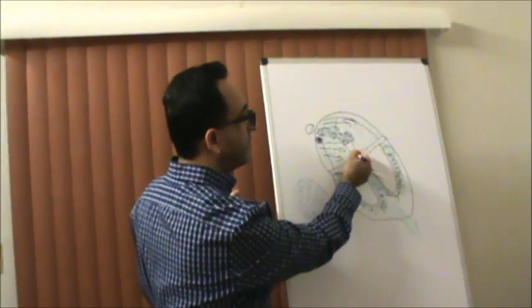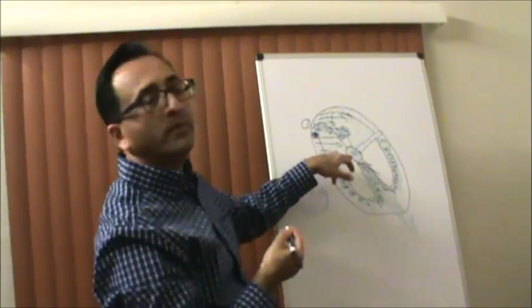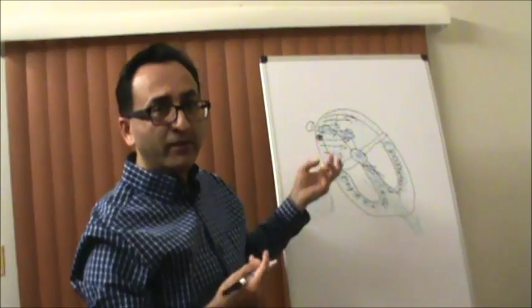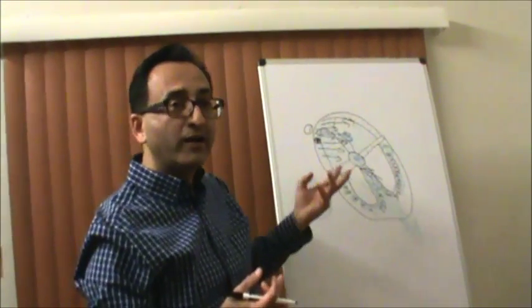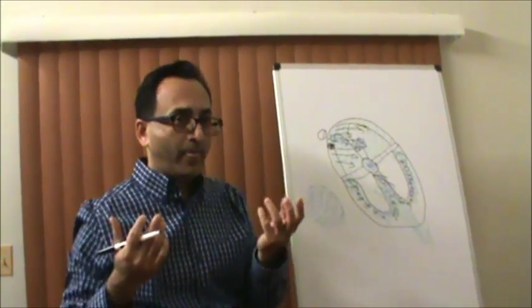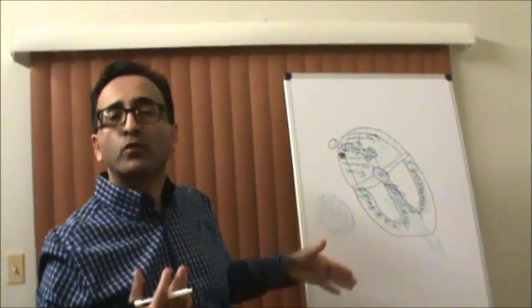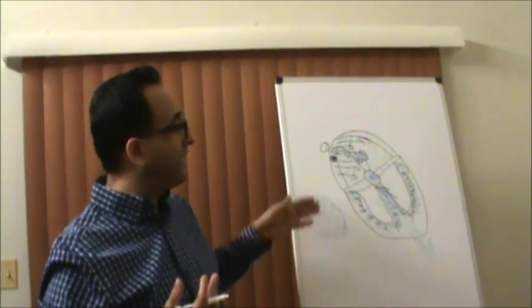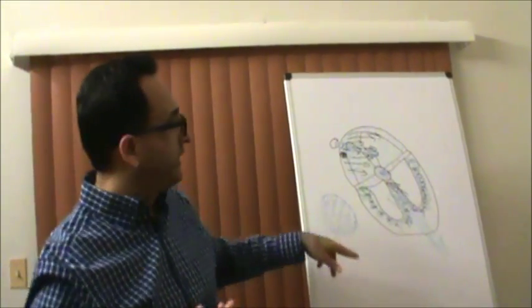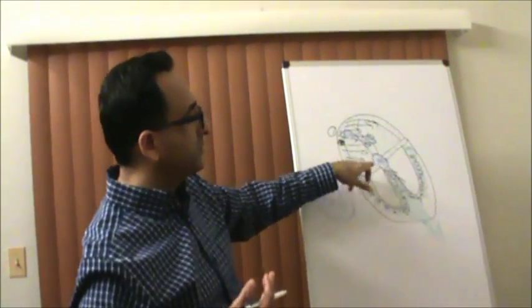Nothing gets noticed on the ECG paper at the time of the stimulation of the AV node, because the AV node is a small tissue compared to the heart, plus the composition of the AV node is such that it slows down the process. It has calcium as opposed to the sodium when we are looking at the Purkinje fiber. So that is the second event that takes place.